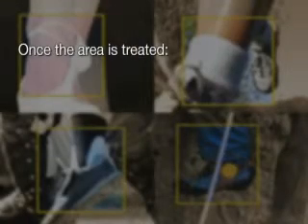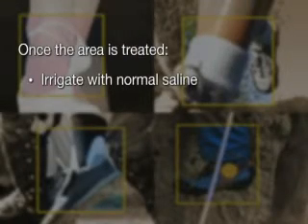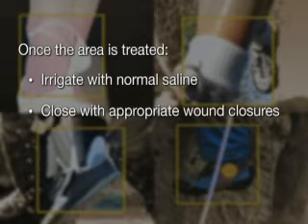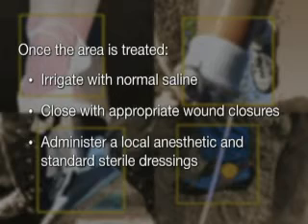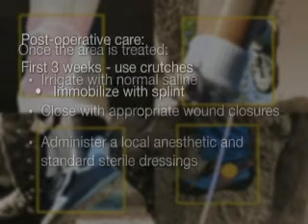Once the area is treated, irrigate with normal saline. Close with appropriate wound closures. Finally, administer a local anesthetic and standard sterile dressings.